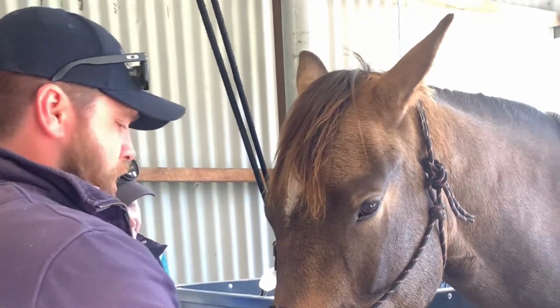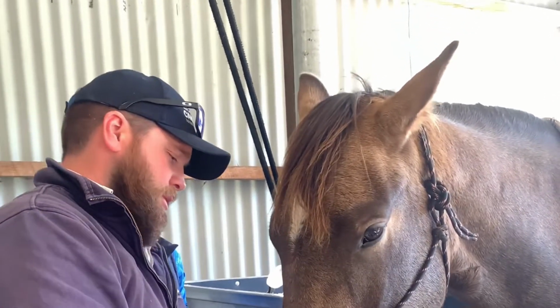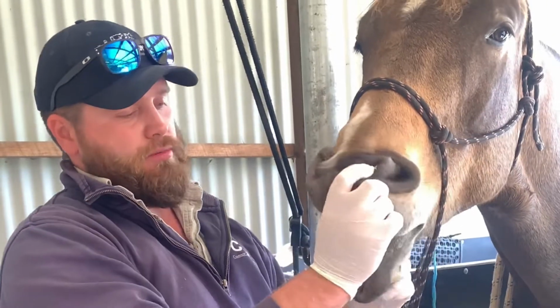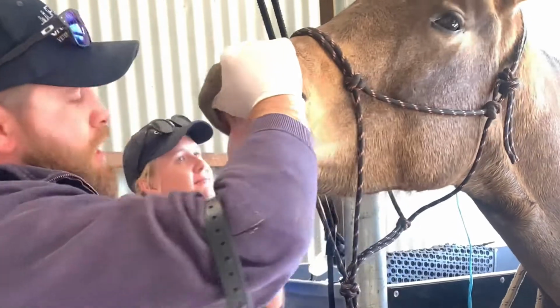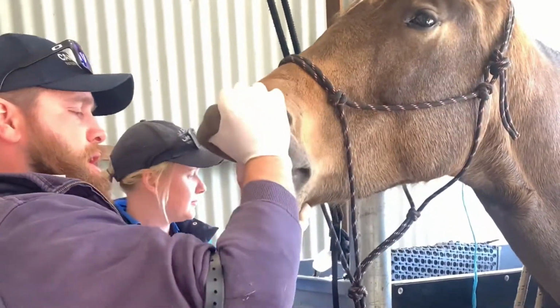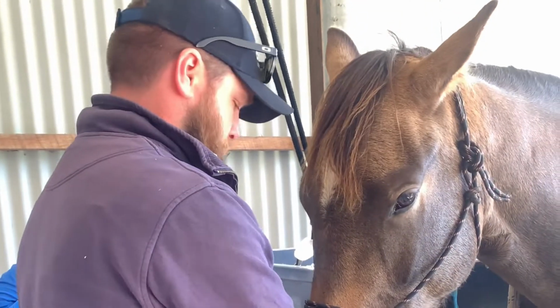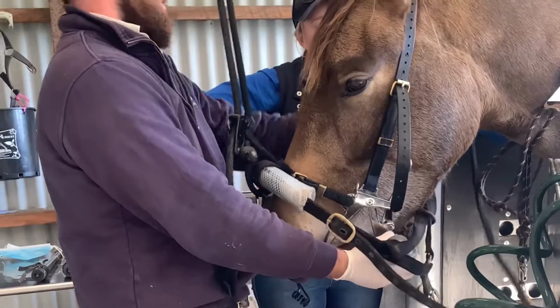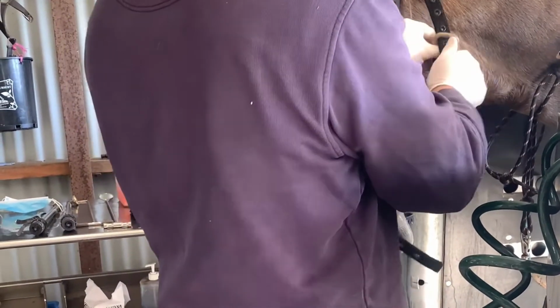We will also palpate the bars of the mandible to see if there are any problems. Sometimes you'll get pain. We want to make sure that we have a normal rostrocaudal motion. So is there an overbite? We always look at these teeth from the side on, and we don't have anything. And then a little bit of contact in his jaw. Cool. All right, so we're getting our speculum on so that we can have a good look inside that mouth. We always have a halter on to help our backs and hold the horse's head up.